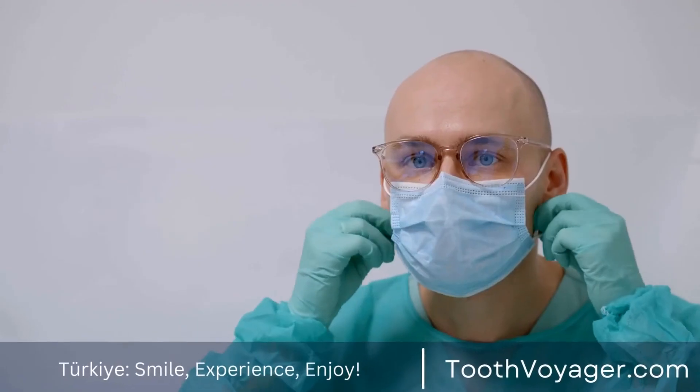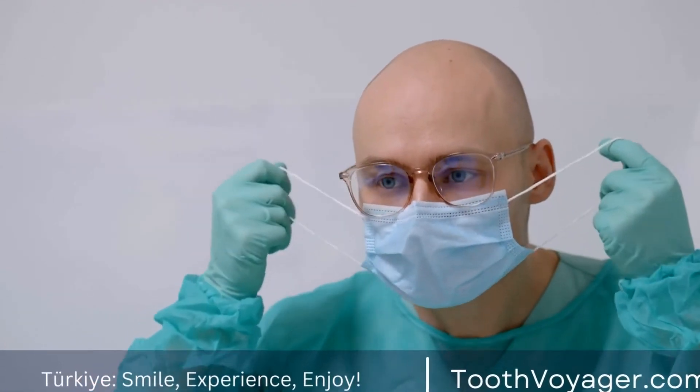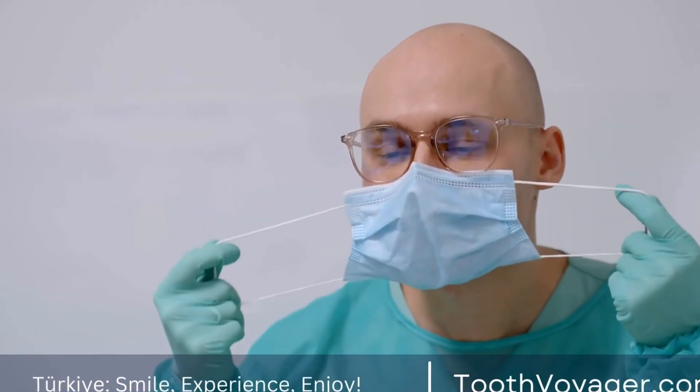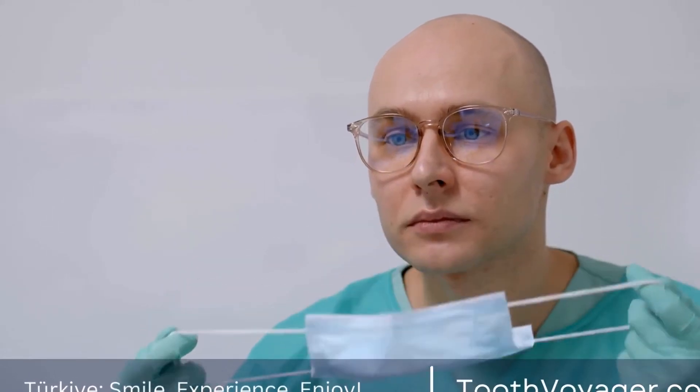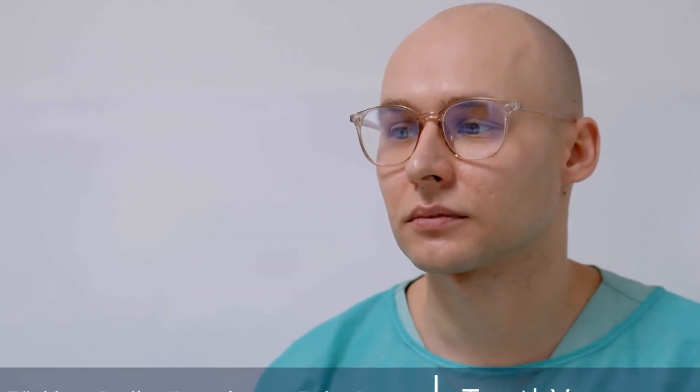Step 7 — Restoring the tooth: After the root canal is completed, the dentist will place a filling or crown on the tooth to protect it and restore its function.